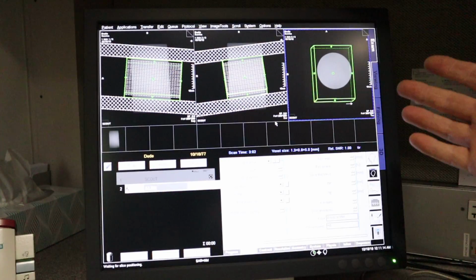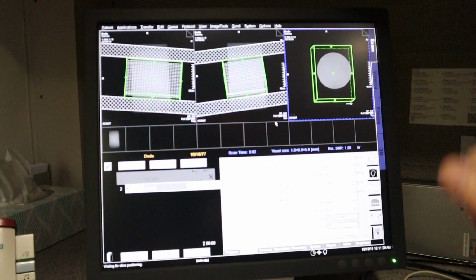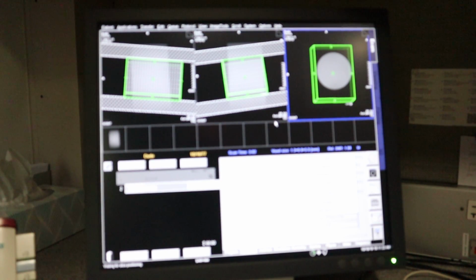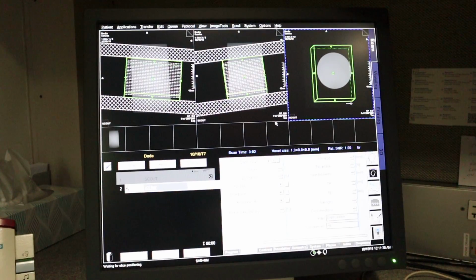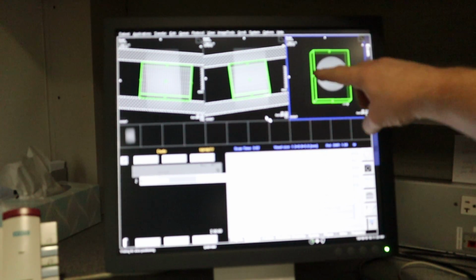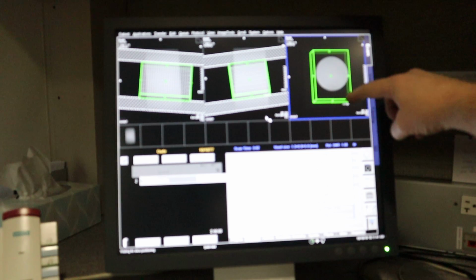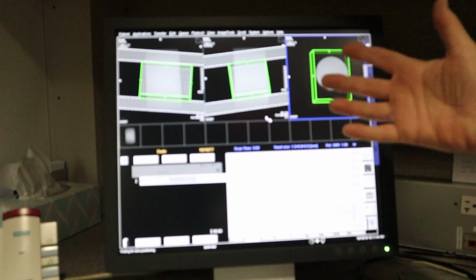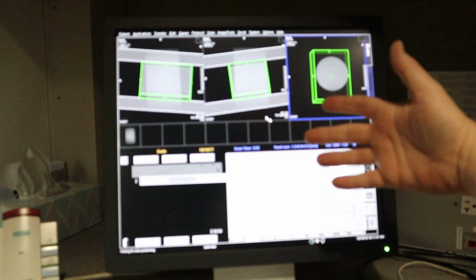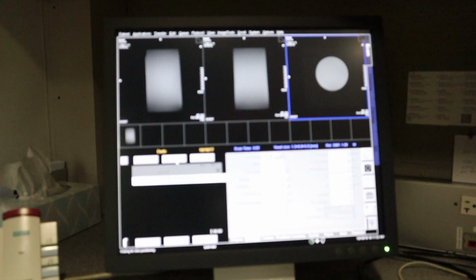If you've noticed in the background here, our box went from yellow to green. And so what does that mean for us? Well, I'm sorry if the camera's not focusing here, but what that means is that anything inside of this green box is now going to get 3D shimmed. And so it's going to actually adjust this box smaller to the anatomy that you're scanning instead of using the total shim. So now we're just going to click apply.